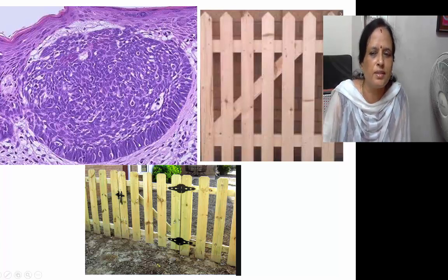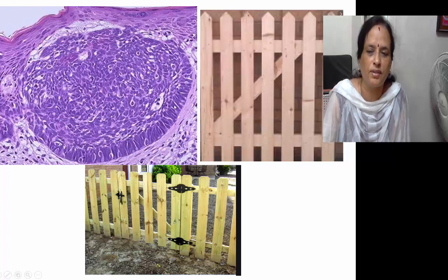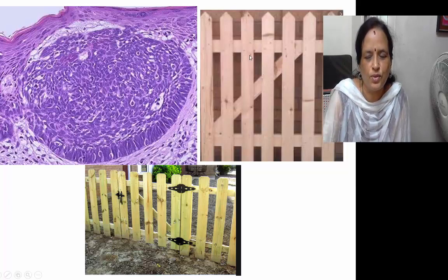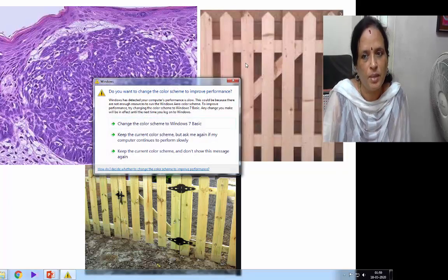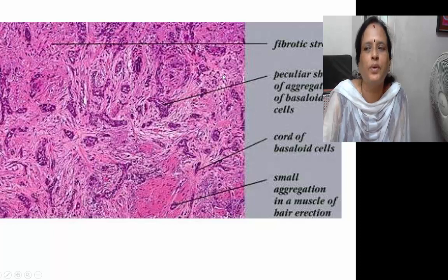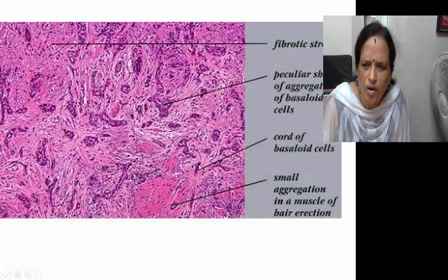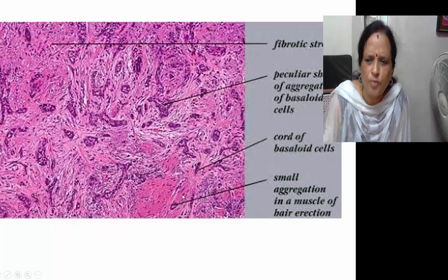The peripheral cells are compared to a picket fence appearance — the cells lying parallel to each other, like the fence we use for a garden. Remember this: picket fence. Looking at the fibrotic stroma again, there are cords of cells and peculiar aggregations of basaloid cells — small aggregates.